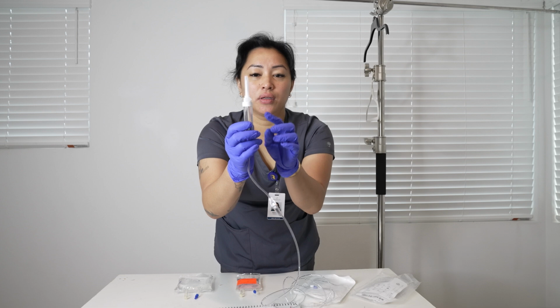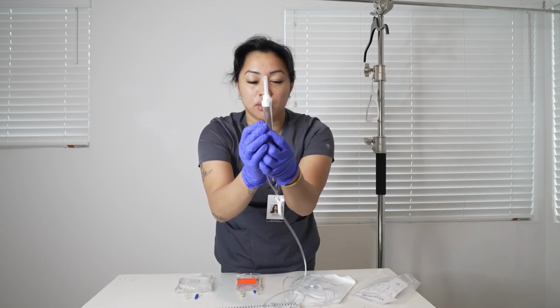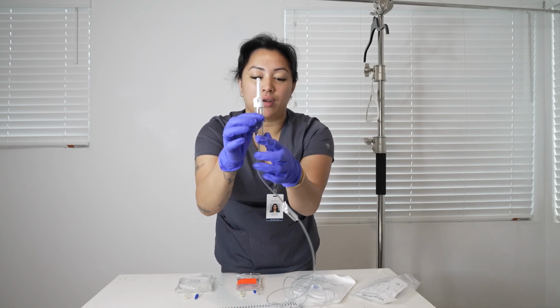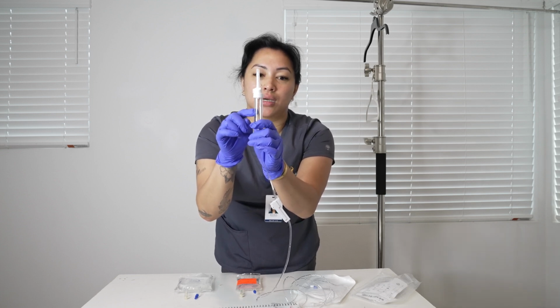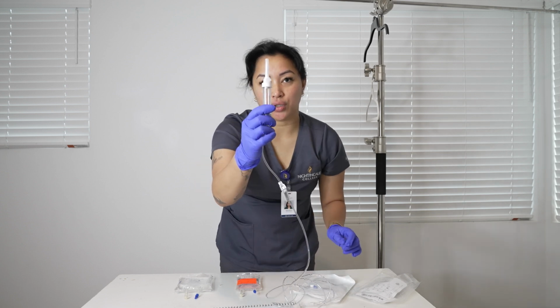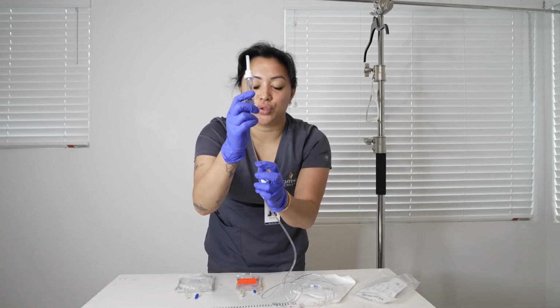This is where you fill up the fluid, and you put it halfway, and then there's air, and this is where you also count how many drops, and this is where you can ensure the proper amount of fluid that will be coming down the tubing.